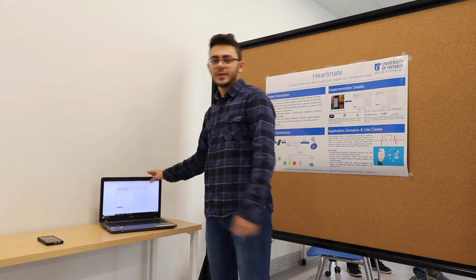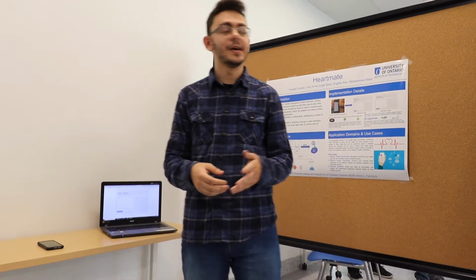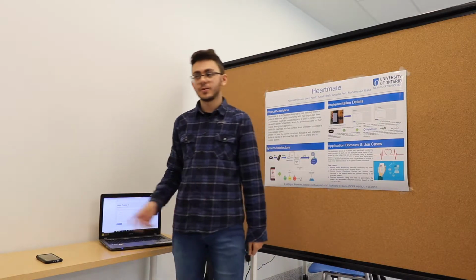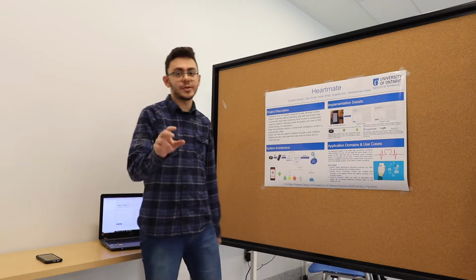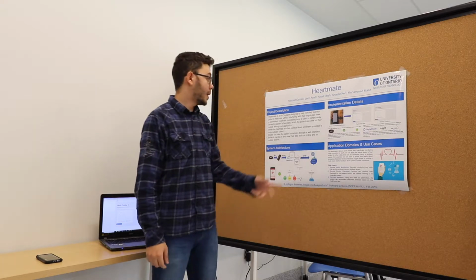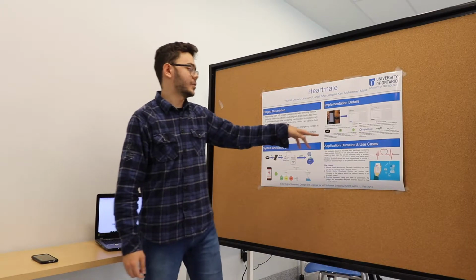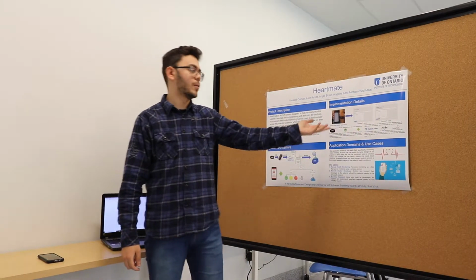And another benefit of this website is that also the patient can access it. So let's say the patient wants to see what he's been looking like throughout the past week. He can just access the website through his own interface and select the date, and he'll get the same graph display, but just for his data. So that's our implementation. For mobile app, we obviously used Android Studio. For our cloud platform, we used DigitalOcean, and for our web app, we used Node.js.